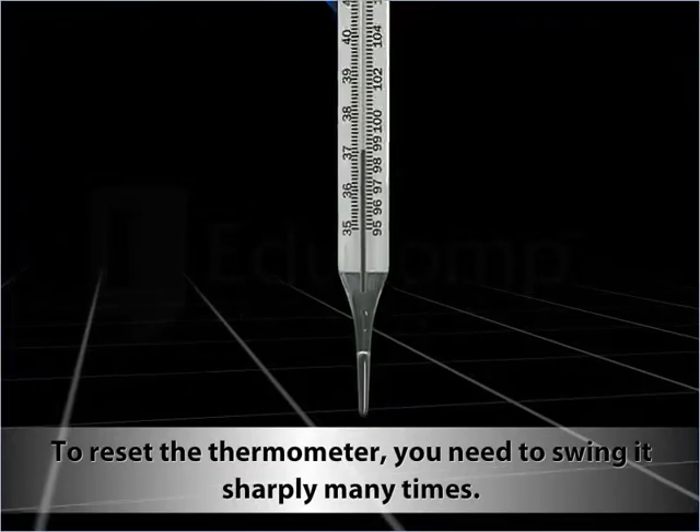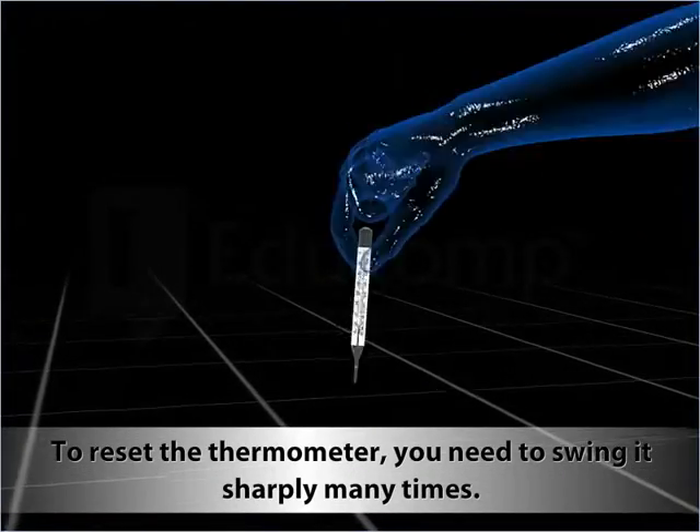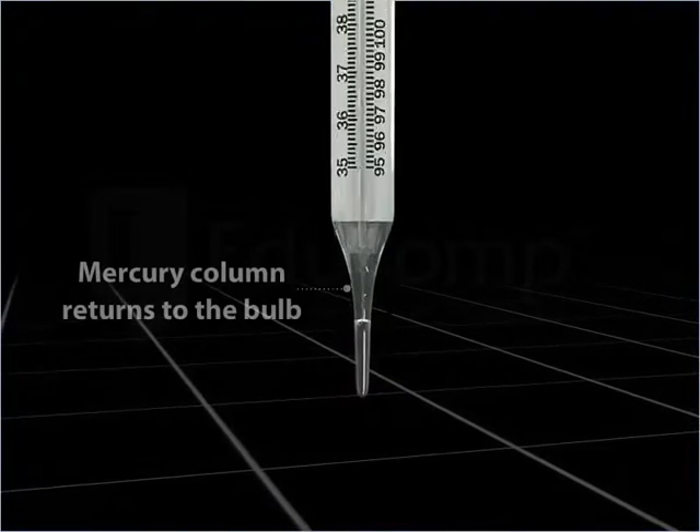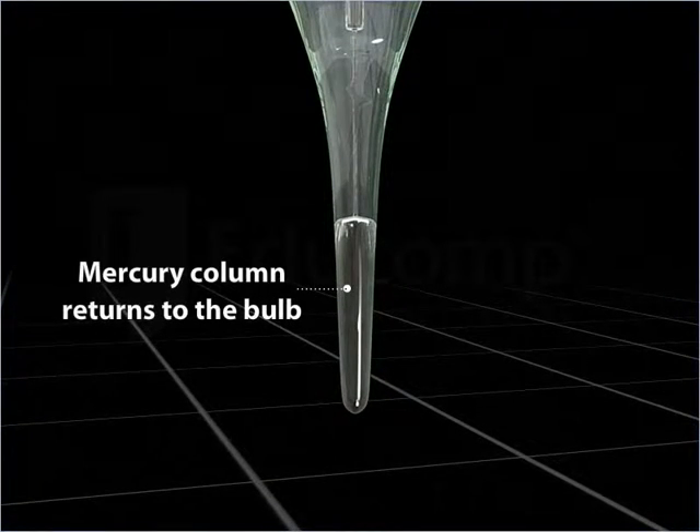To reset the thermometer, you need to swing it sharply many times so as to make the mercury column return to the bulb.